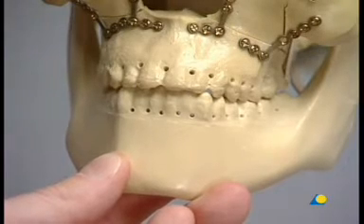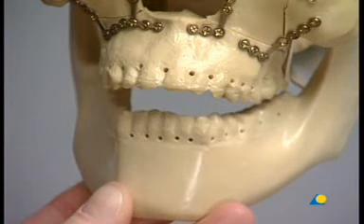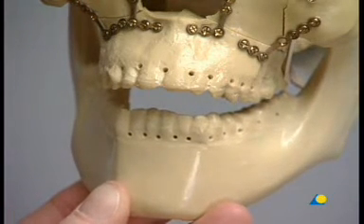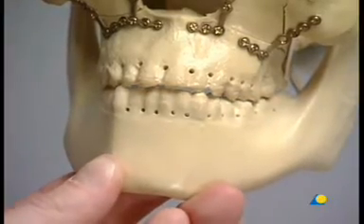Following reduction at the LeFort 1 level, the MMF is removed and the occlusion is checked. This step completes the plating of the basic framework of the midface.